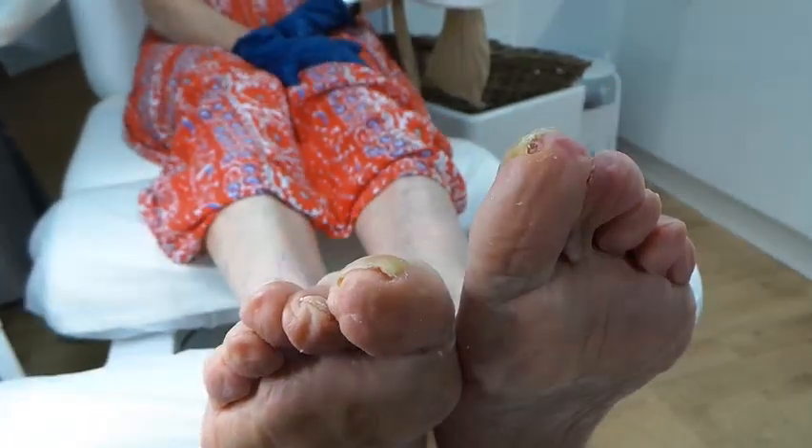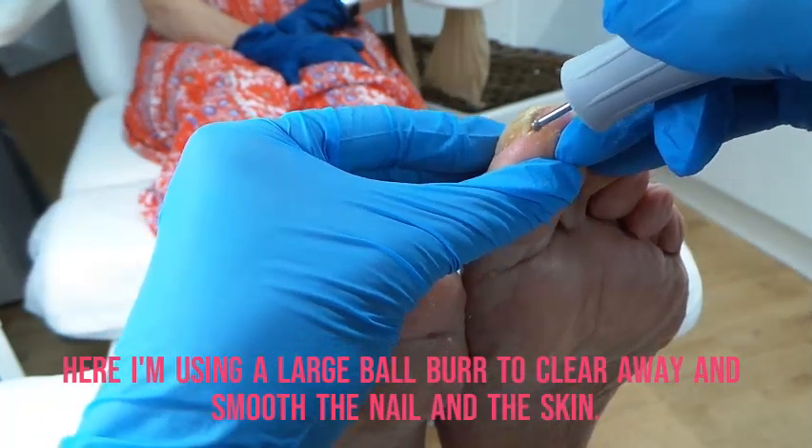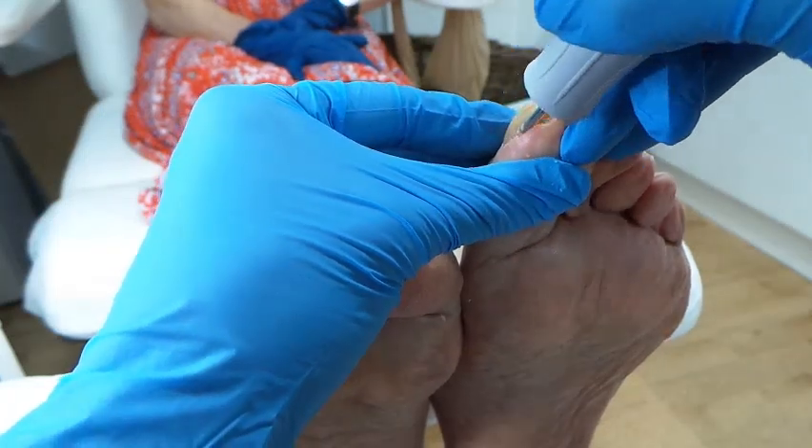There we are. Let me know if that's uncomfortable — is that okay? It's just a nice little ball drill.